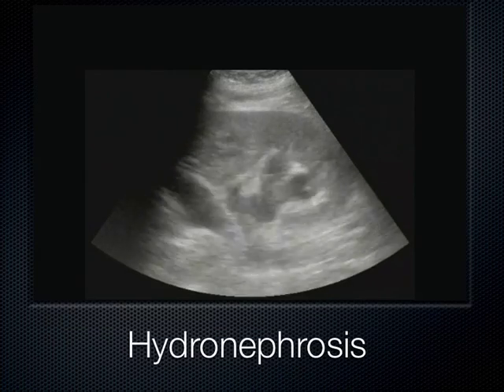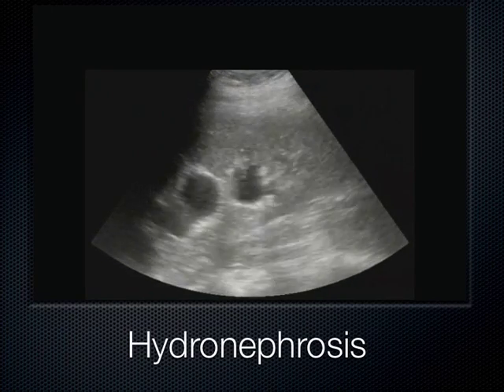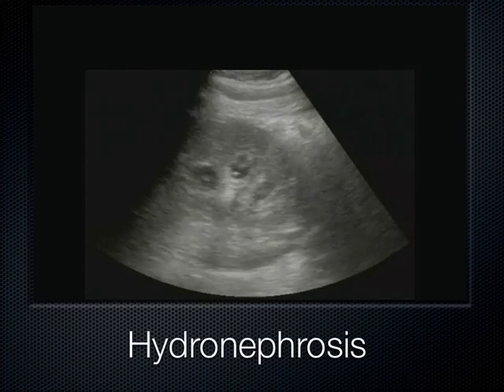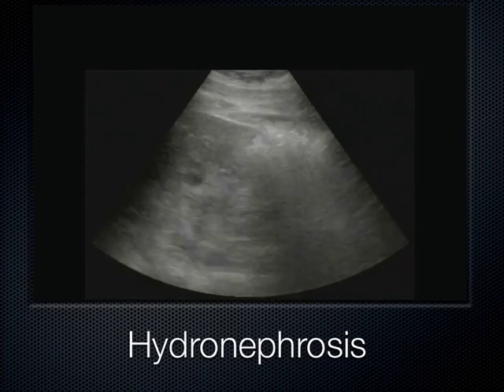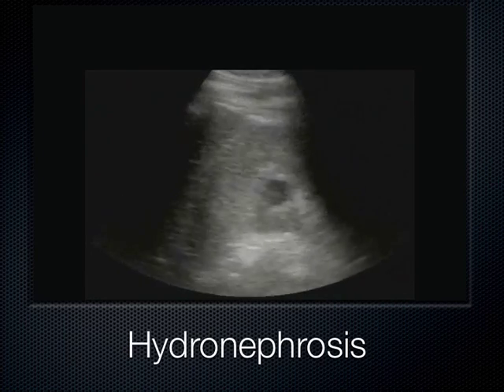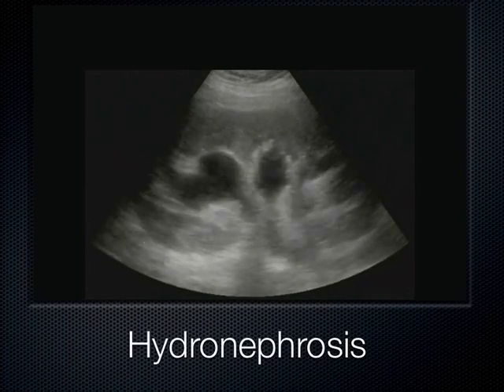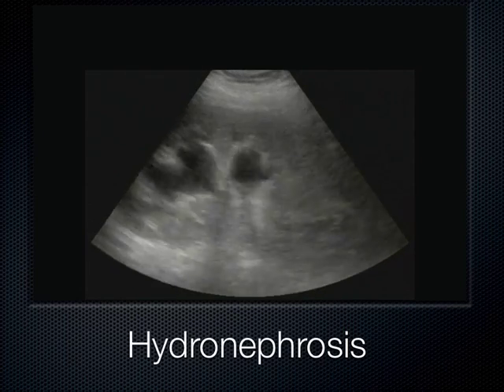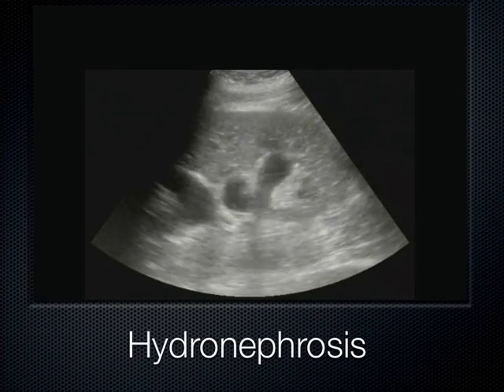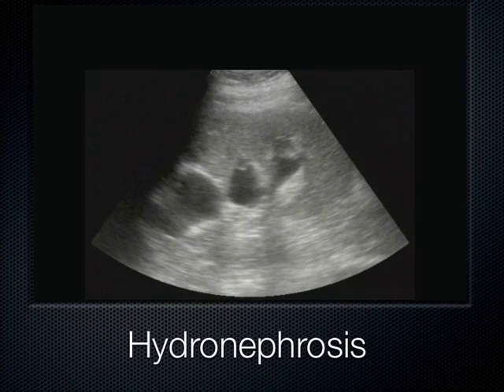But you move on, you see a little bit more. See, we can see the fingers of the glove kind of going out into these different projections. They eventually all coalesce, but not until we get to right at the renal sinus does it coalesce down here. So that's another bit of, I would say, mild amount of hydronephrosis. It's a very nebulous grading category, but here it's sort of splaying out a little bit, sort of mild. We can still make out plenty of cortex. This is all cortex out here. There's plenty of cortex left in that kidney.